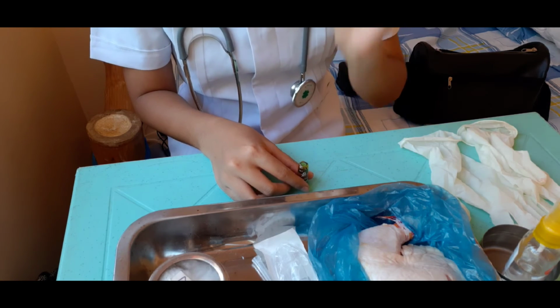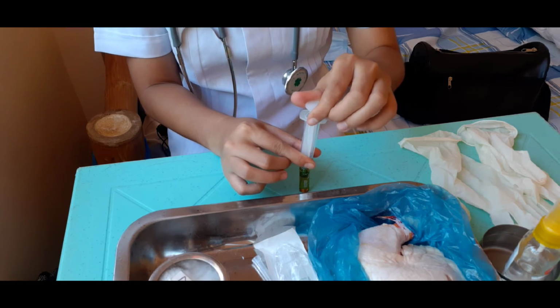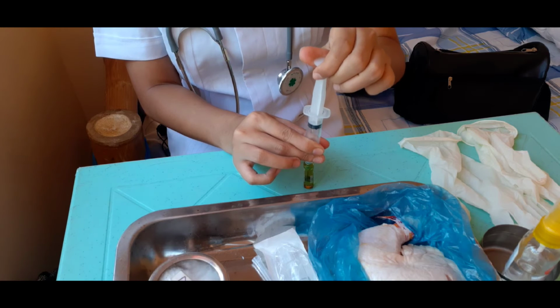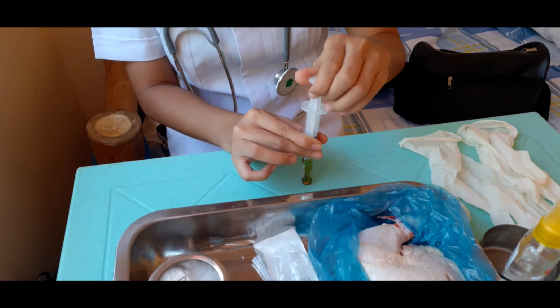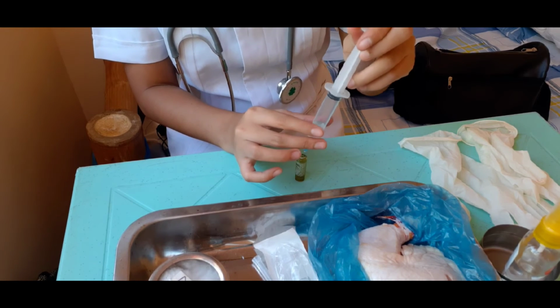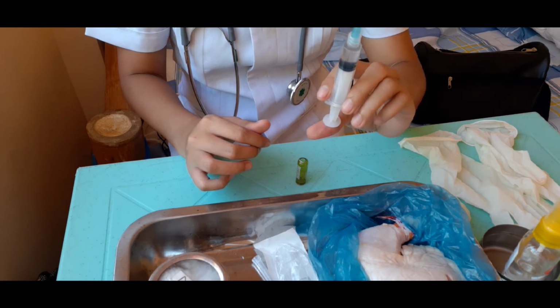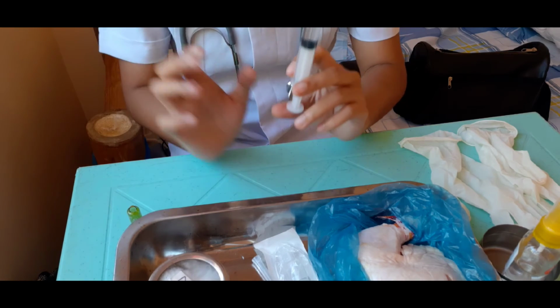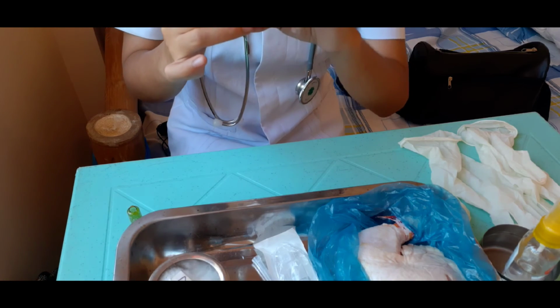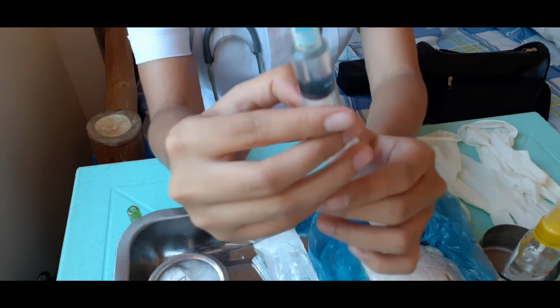So I put it here and then withdraw. After that, it is time that we are now going to push some solution out of the needle to the prescribed amount. So that is what we will see.